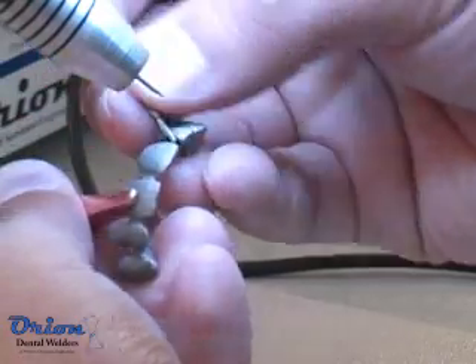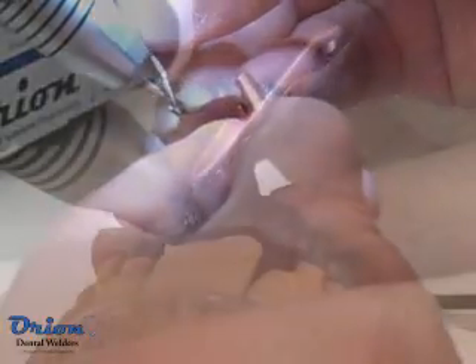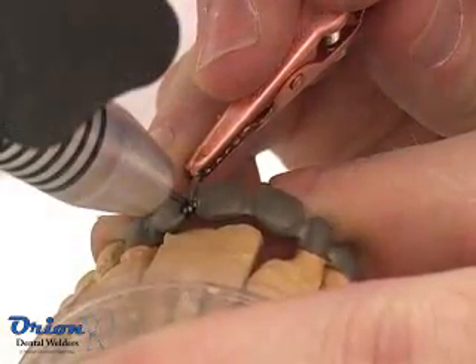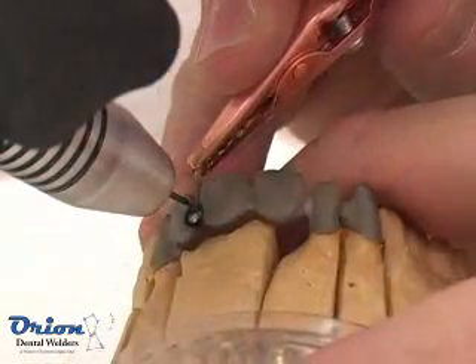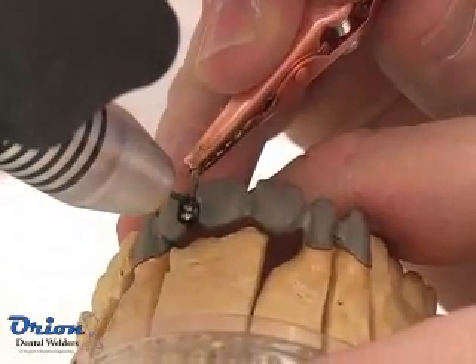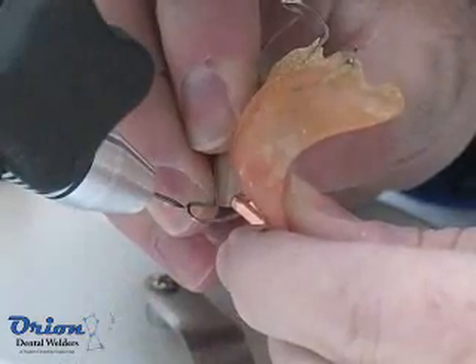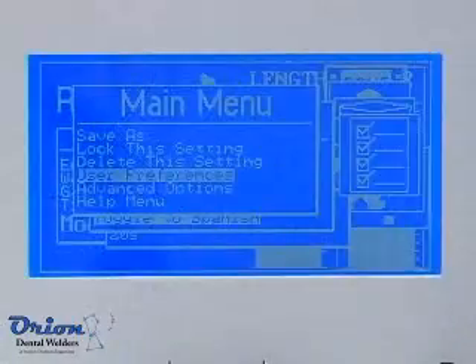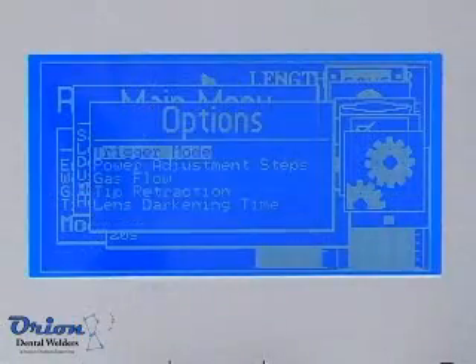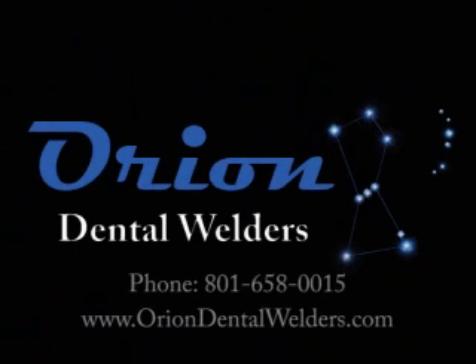If you start to have trouble producing or igniting an arc, it is time to maintain the electrode. Some metals are more prone to sticking to the welding electrode during the welding process. Do not apply too much pressure when welding — only very light pressure is needed. The less time the electrode is in contact with the molten weld pool, the less likely contamination will occur. Use the advanced menu item Tip-Retract Timing to start the Tip-Retract process as soon as possible for your welding preference. For more information, contact Orion Dental Welders.